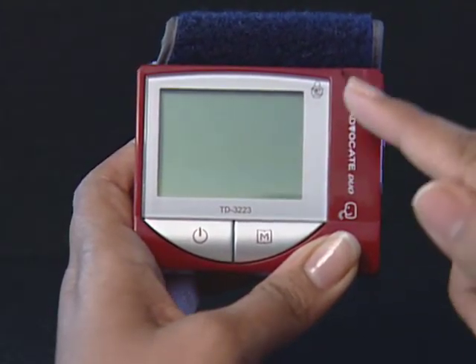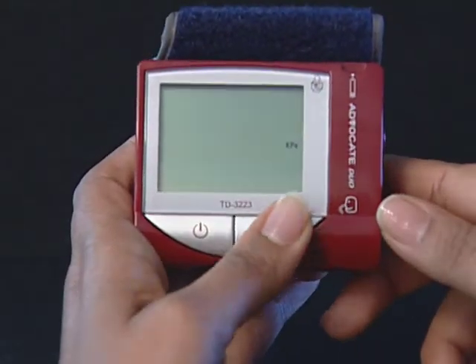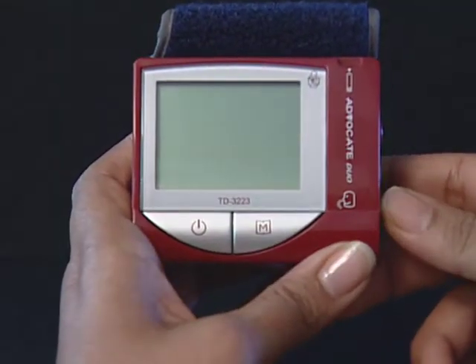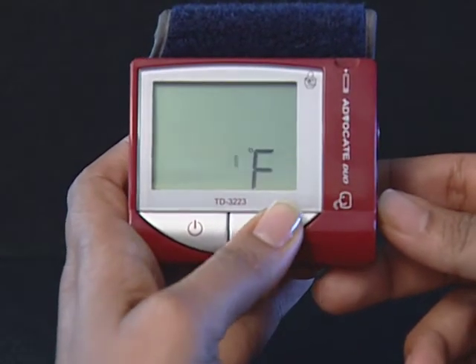Select the unit of blood pressure — either millimeters of mercury (mmHg) or kilopascals (kPa). Your meter can display test results in millimeters of mercury or kilopascals. Use the unit of blood pressure that you are most familiar with. Press and release the M button until the unit of blood pressure you are choosing appears on the display. Press the set button and the current unit of temperature will start flashing.